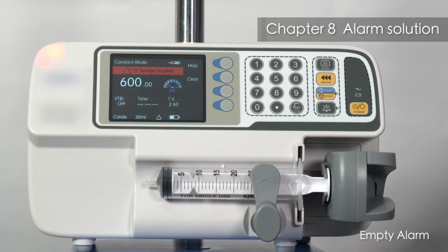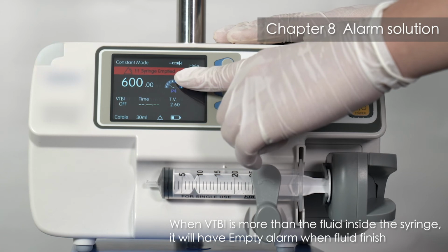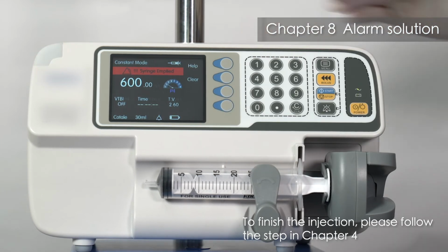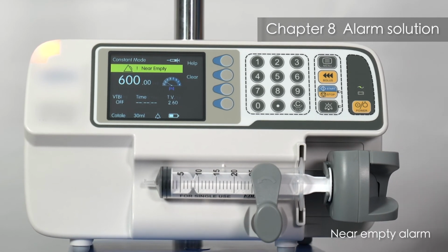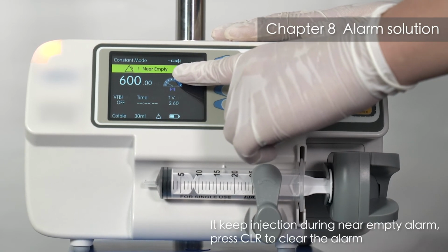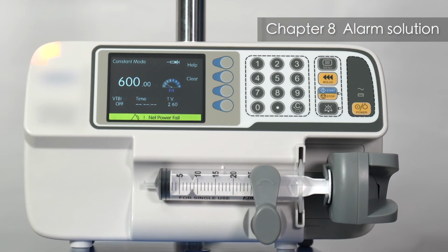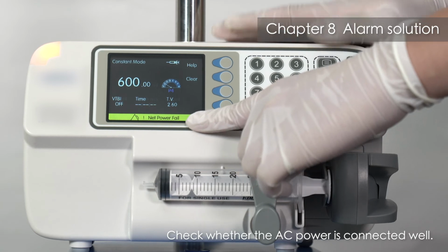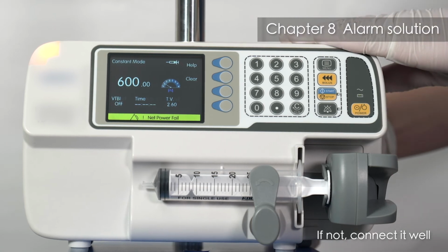Empty alarm. When VTBI is more than the fluid inside the syringe, it will have empty alarm when fluid finish. To finish the injection, please follow the step in Chapter 4. Near empty alarm. It indicates the fluid is going finish. It keeps injection during near empty alarm. Press CLR to clear the alarm. AC power disconnect alarm. Check whether the AC power is connected well. If not connected well.